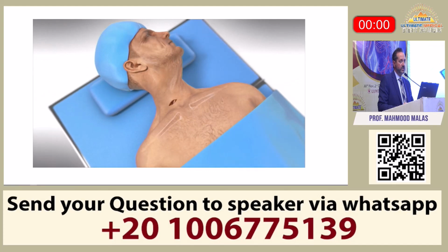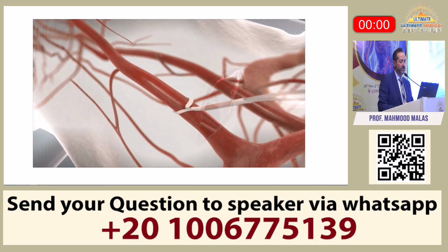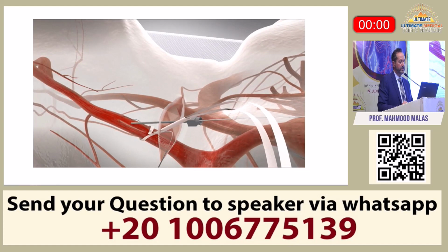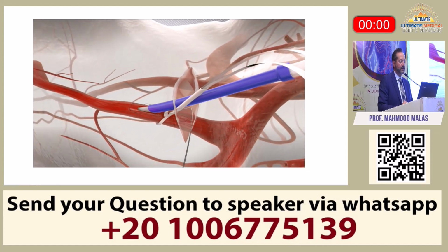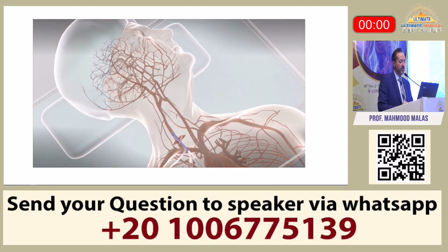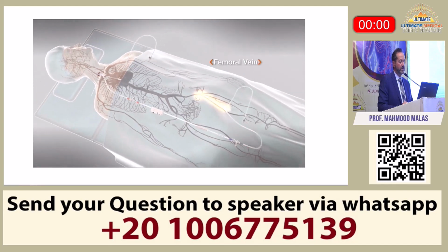So here you make the small incision, transverse or longitudinal, and then you put your stitch, there's umbilical tape, and then you put your purse string stitch ahead of time, and then you put your micropuncture wire needle back to the stiff wire, and then you put your arterial sheath, you dilate, here a little bit, and then you put your arterial sheath. And then you have also the venous sheath. Once you connect them together, you'll see here this in a second. I wish we can expedite a little bit, but this is the venous sheath.